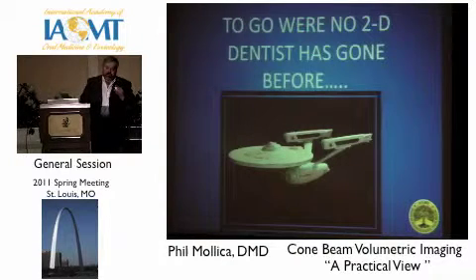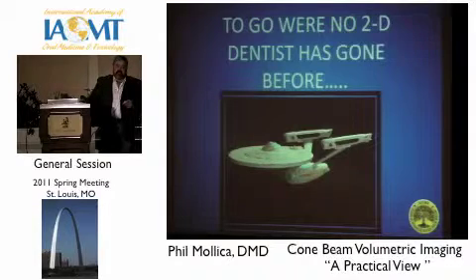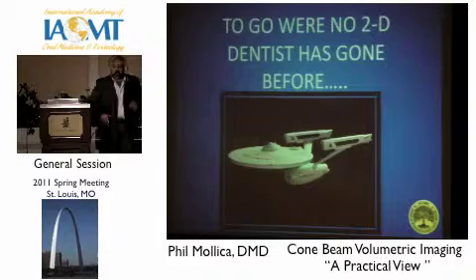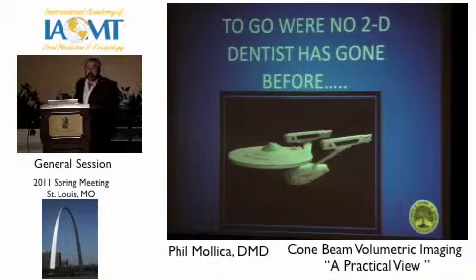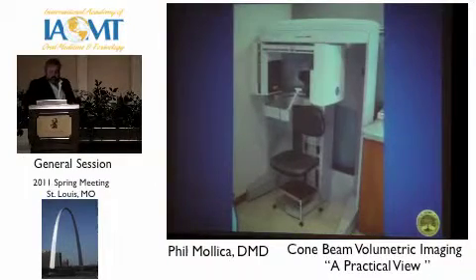When you look at a panoramic X-ray or a PA, you say, wow, that doesn't look too bad. And then you start hovering in on 3D cone beam and coming in left, right, up and down. You go, woo, where did that come from? Where did that come from? Let me go back a little bit.